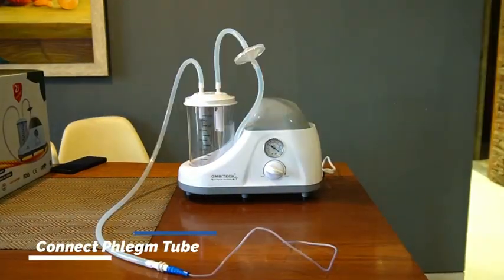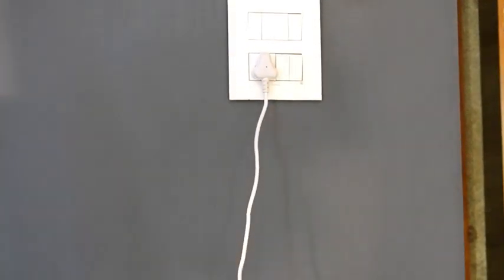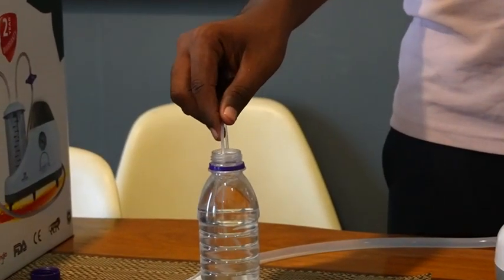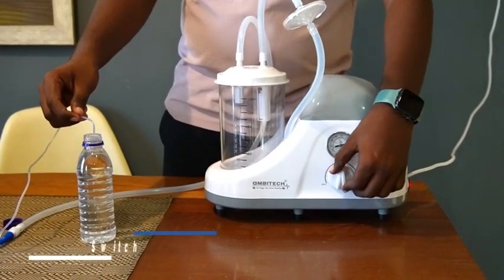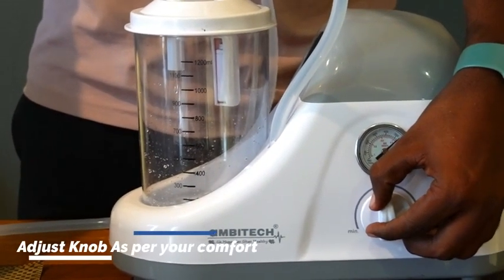The suction unit is ready for use. Now, let's look at how to use the suction unit. Start by connecting the power plug and pressing the power switch. Turn on the machine switch. Here we'll see how the suction works with a bottle of water. You can adjust the suction rate by twisting this knob between minimum and maximum pressure. Turn the knob from minimum to maximum until you find a suitable and comfortable phlegm or mucus suction.